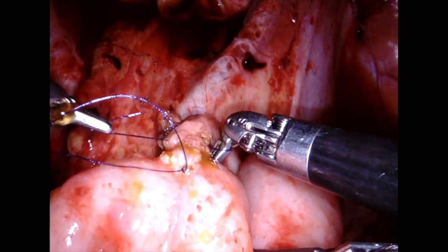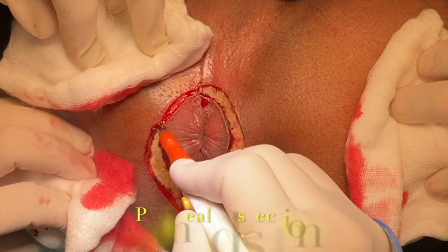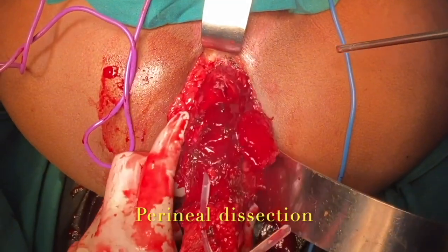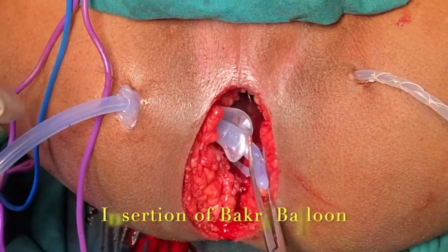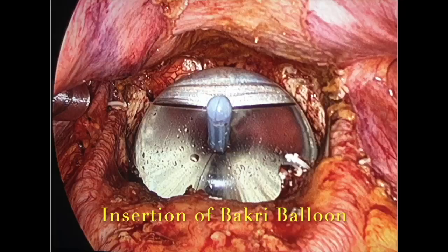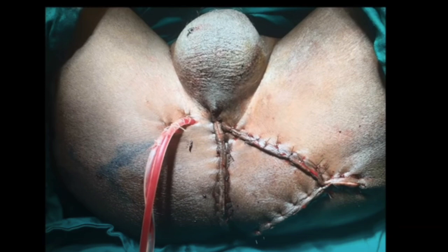Following this, the colon is brought out as the sigmoid stoma and the urostomy is brought out. Perineal dissection is done in standard fashion and the specimen is delivered. A Bakri balloon is placed in the pelvis to prevent empty pelvis syndrome. This is the post-op picture.